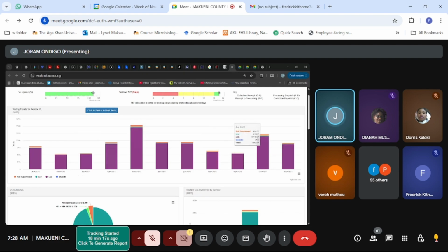So from here, in your view, you can actually see May 2025 nationally was the month with a lot of viral loads done. And of course, they have even calculated the suppressions and even the invalids and the LLDs and LDLs. Of course, you know LDL and LLV. LLV is low level viremia. LDL is lower detectable limit, that cannot be detected. Invalids are samples that you know they ran, but they were not able to get results. So in total, they did 154,164.